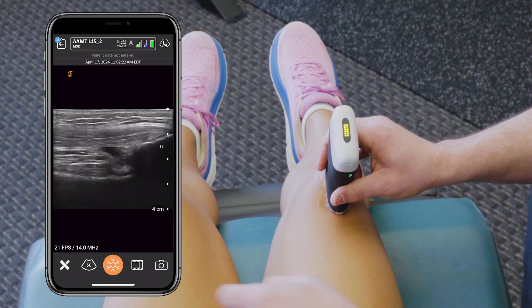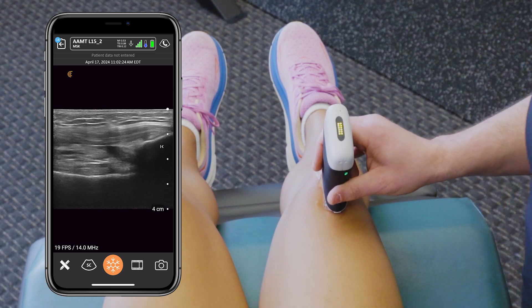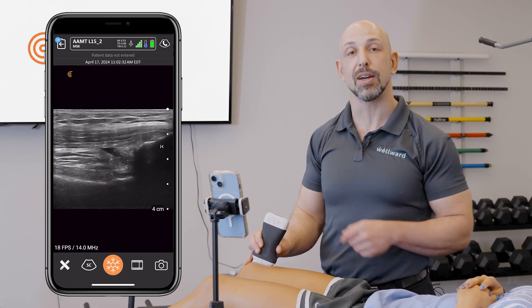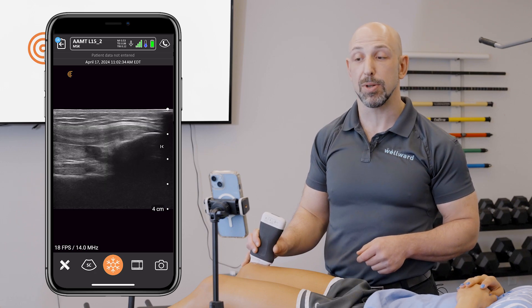Then you start to employ musculoskeletal sonography. That's going to provide the specificity that's missing with most clinical exams. Oftentimes when you're trying to find the specific cause of pain, MRI or x-rays are utilized, and that can be helpful in some cases. But the benefit of ultrasound is that the person is right there in front of you — you've just poked them on that spot and they say, that is the pain, that's the spot.